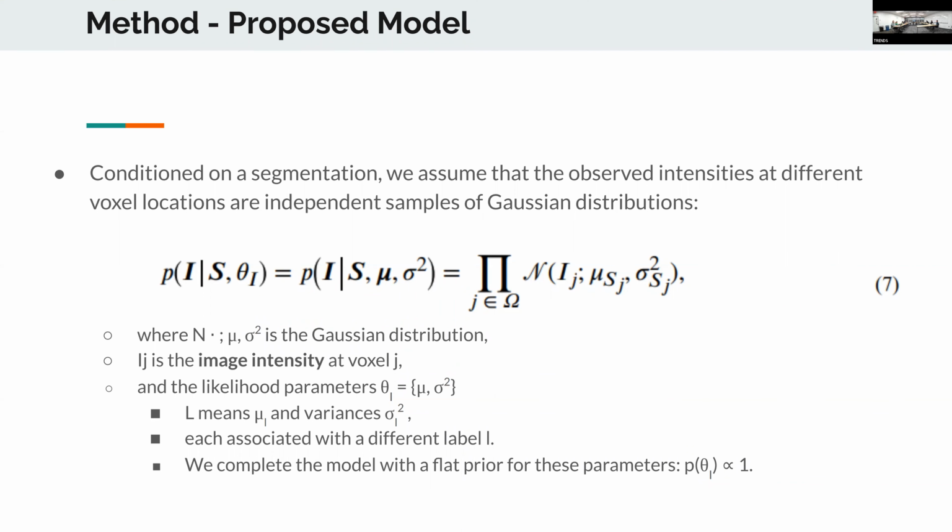Otherwise, everything will be just a white noise kind of thing. It's not, because it's based on that average and that standard deviation output from the model. So I wouldn't call it white noise. No, but it's Gaussian at each voxel. Okay, it will be white. White noise is something from Gaussian at each voxel. But the prior, the actual voxel value heavily weighs just one of the possibilities.